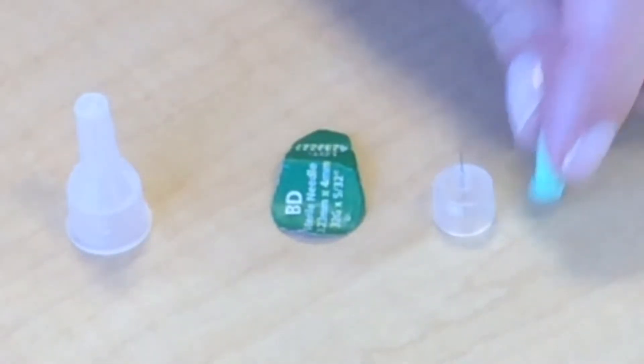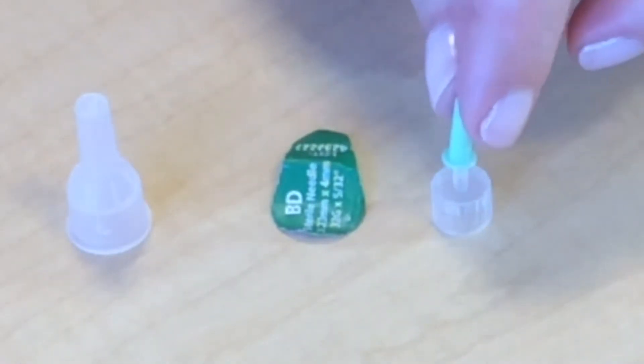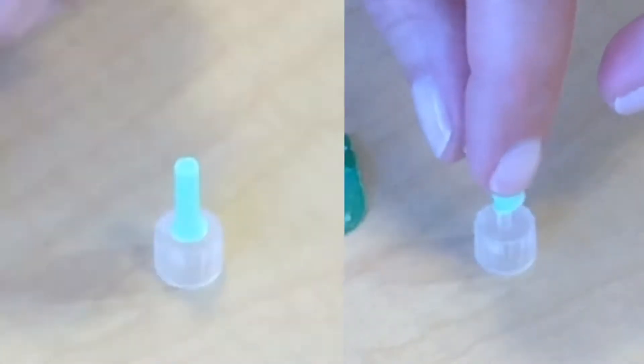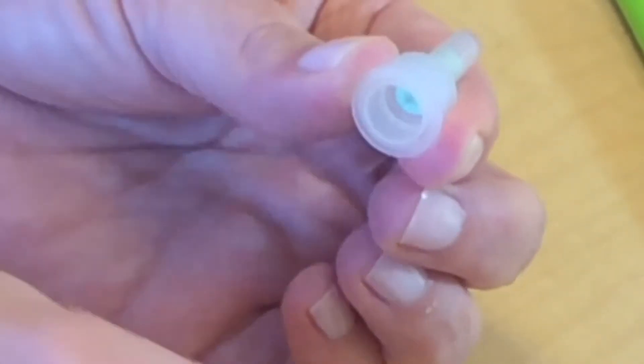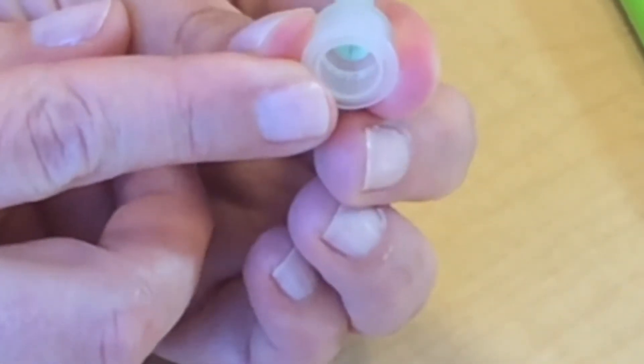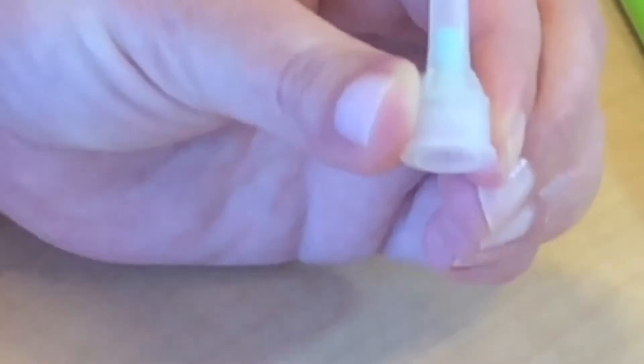How they go together when you first start out is: there's the inner cap on the needle, then the outer cap, and then your safety peel. When you get your needle, you're going to take out the safety peel, and your inner needle will stay in this cap until you're ready to inject.